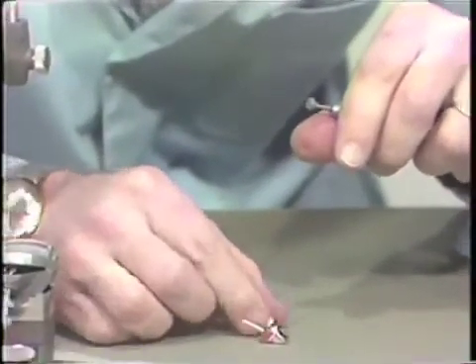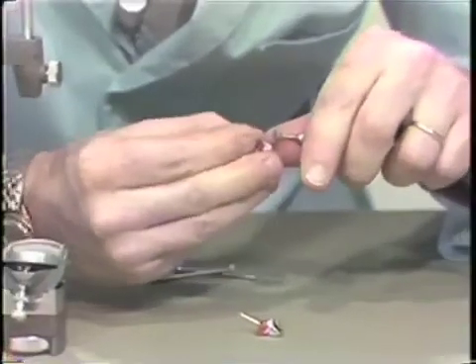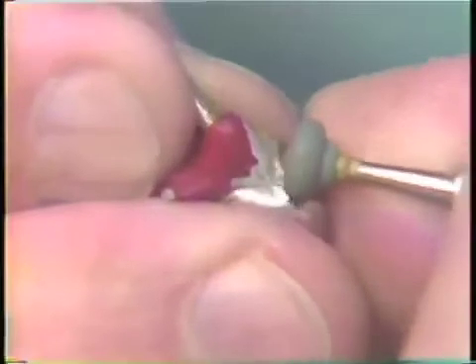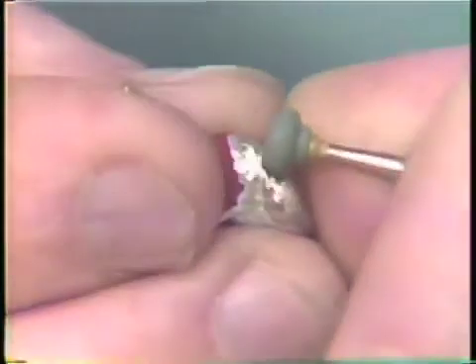The same is done with the other casting, thinning the bulky margins and restoring the contour back to the gold casting.